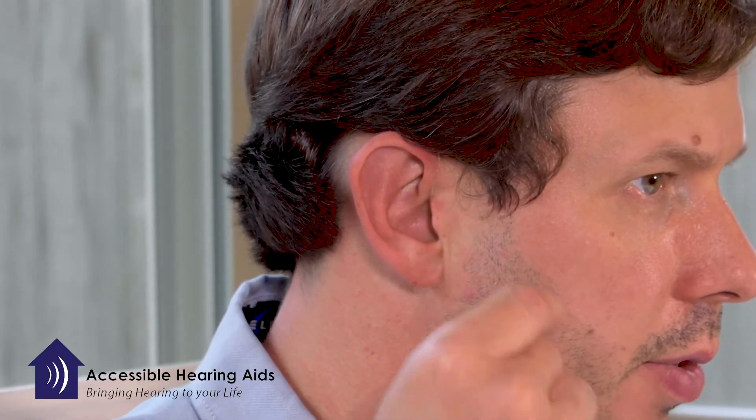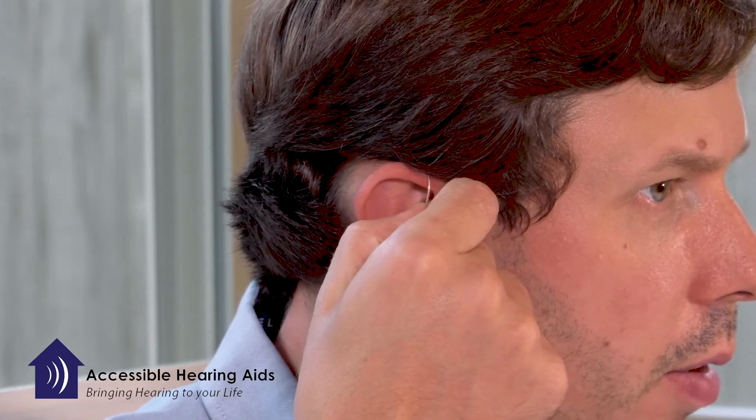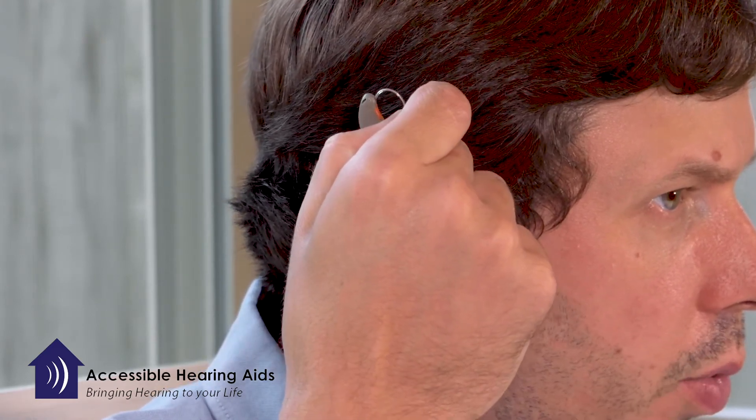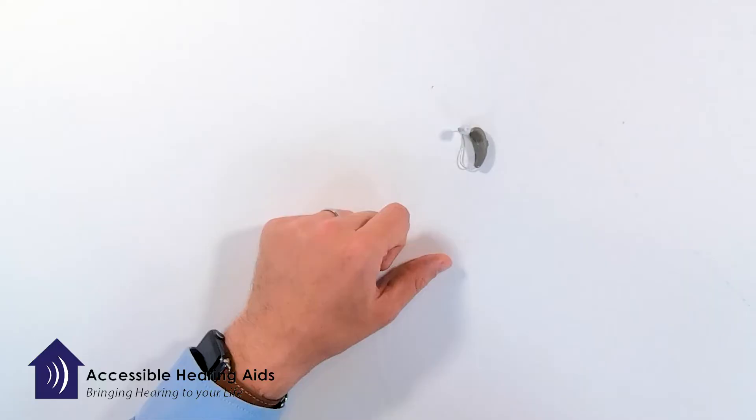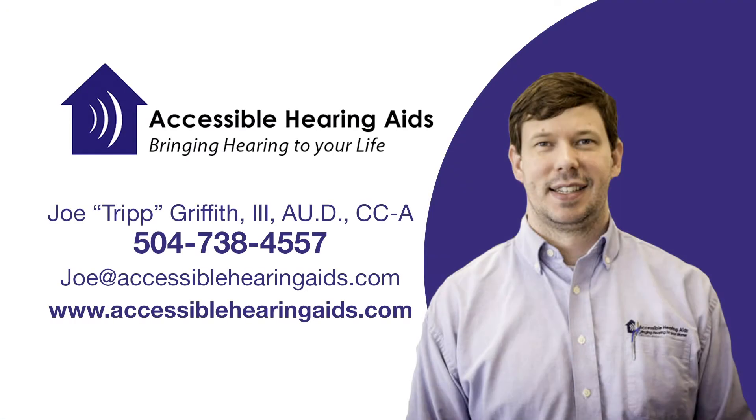When you're ready to remove the hearing device, you gently just grab the wire and pull out and up and it will gently take the hearing device off and out.